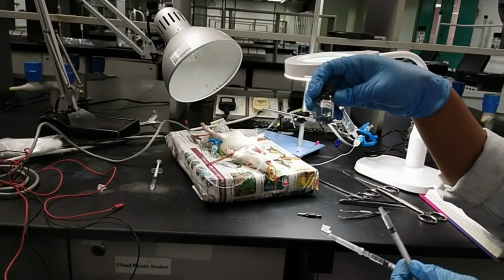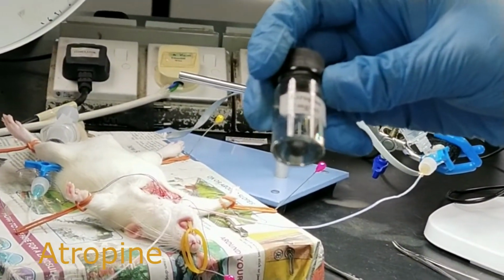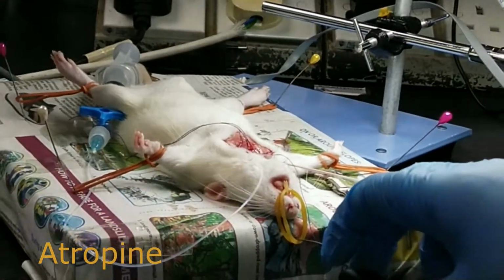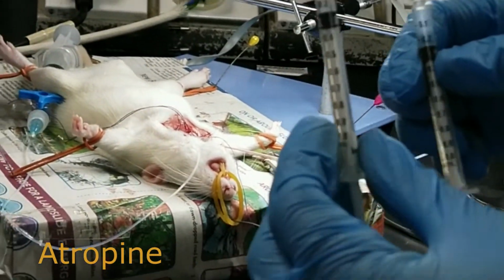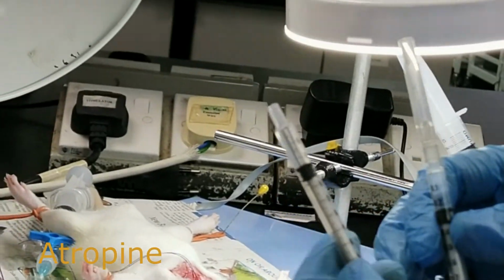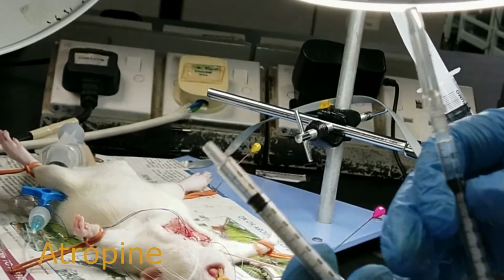So now we're going to proceed with the atropine. The concentration for atropine is 1 mg per ml, and the dosage for the injection is 2.5 mg per kg. Based on that, we need to inject the rest by using two methods. The first method is to inject through the IV, and then we're going to inject through the IP as well. So we're going to divide the total volume by 2.